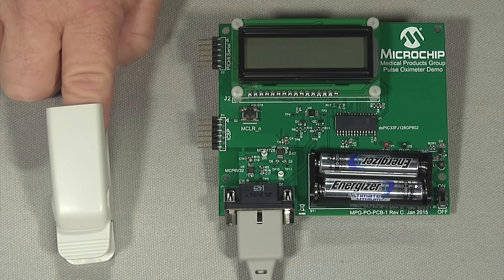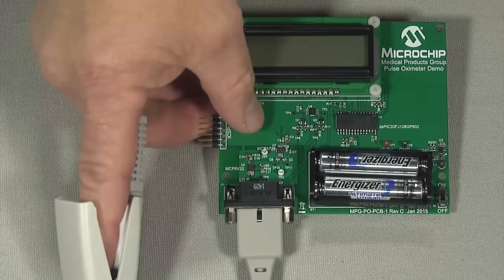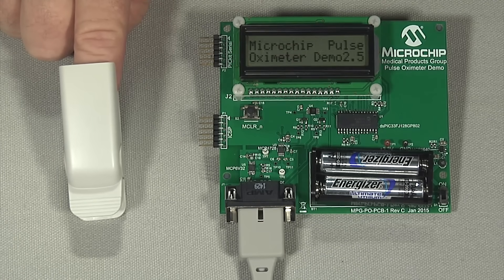Let's see what the whole measurement process looks like. My finger is in the probe, so now I'll start the measurement by pressing the button on the demo board and look for the results on the demo board's LCD display. By the way, the LCD display is driven from an integrated PWM on the same DSPIC33 DSC.